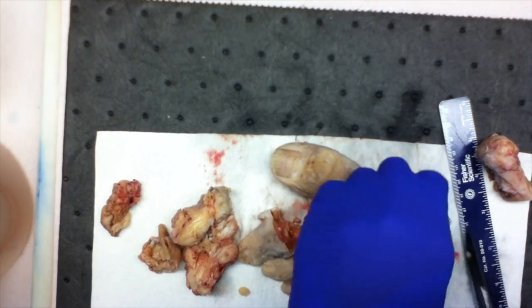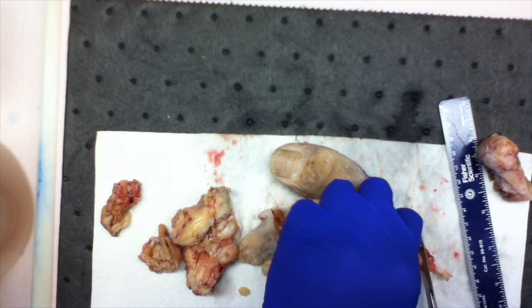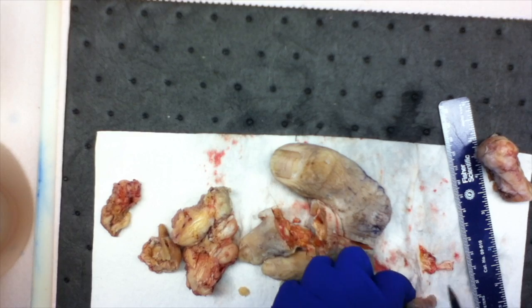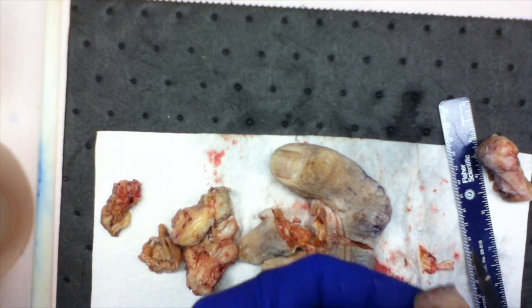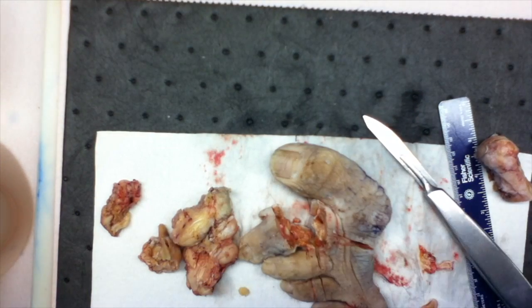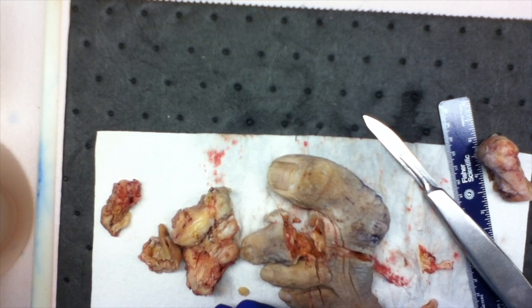And again, I'm basing all this information on what clinically they suspected on the MRI as being the site of osteomyelitis, which is why they've taken this guy's foot. So, I'm going to keep going after exactly what clinically they suspected.